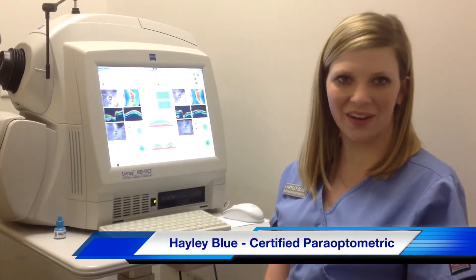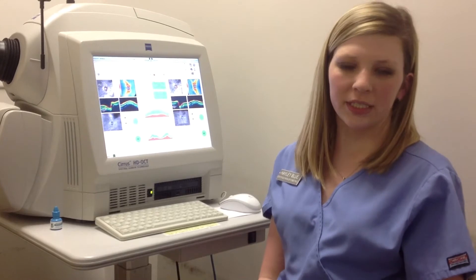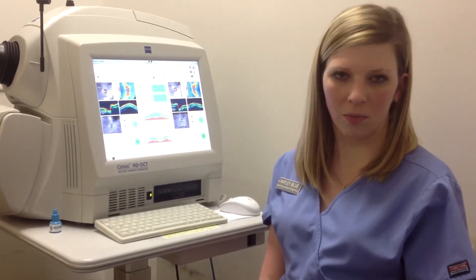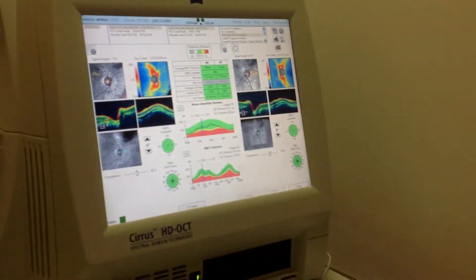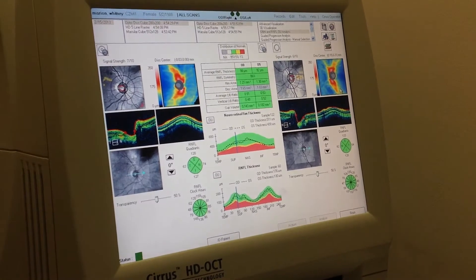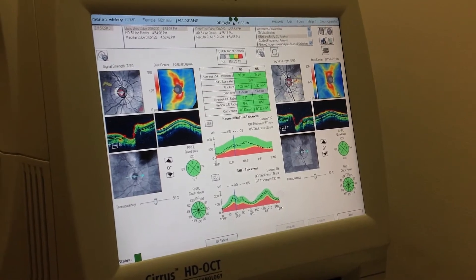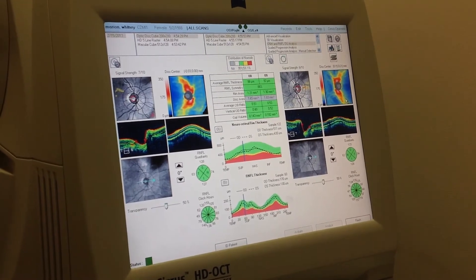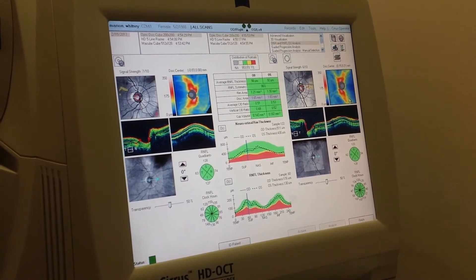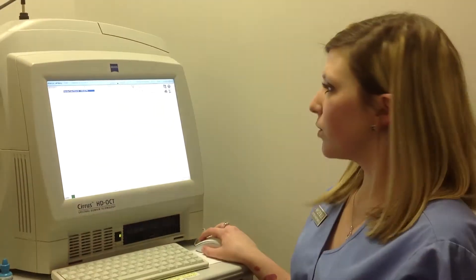Hi, my name's Haley. I'm a certified paraoptometric, and today I'm going to show you our ocular coherence tomographer, or OCT for short. We use our OCT to monitor our macular degeneration and glaucoma patients. On the screen I have a scan of the optic nerve. It compares right eye to left eye to monitor for symmetry. This machine is very detailed and can give us information about specific areas we might want to monitor, and we can track change over the years. We can also check the macula for our macular degeneration patients.